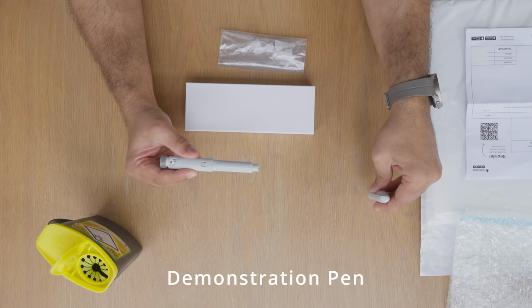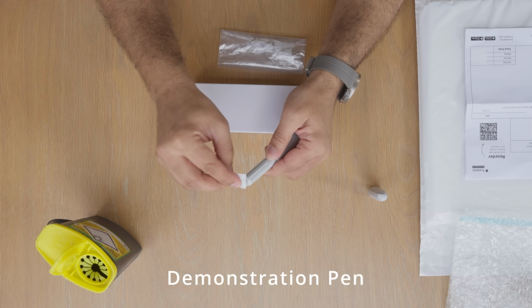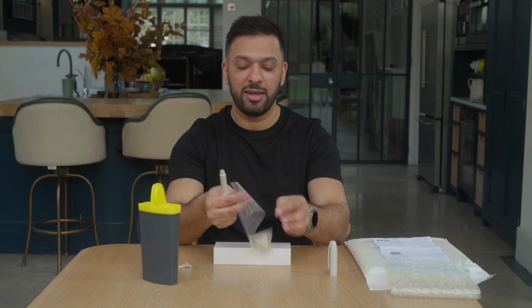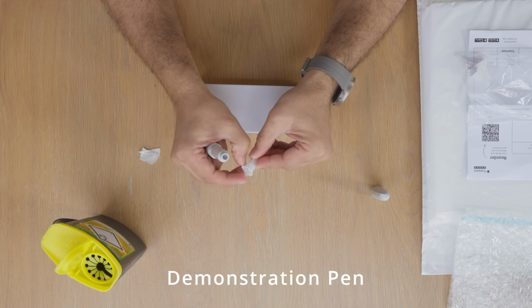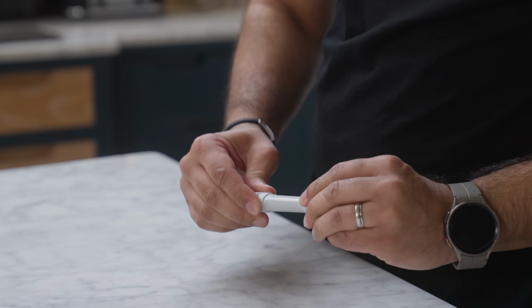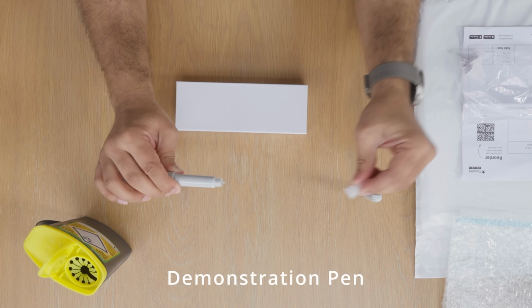When you are ready to inject, remove the cap, take a swab and clean the top of the pen. Remove 1 needle from the pack, take off the paper cover, push down securely and twist until in place, and then remove the plastic cap.